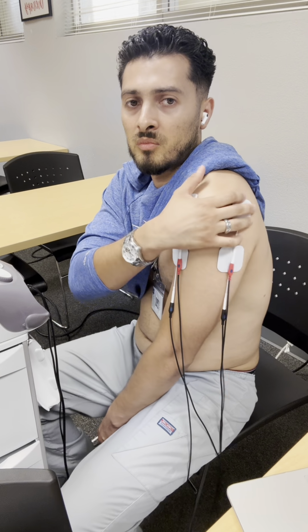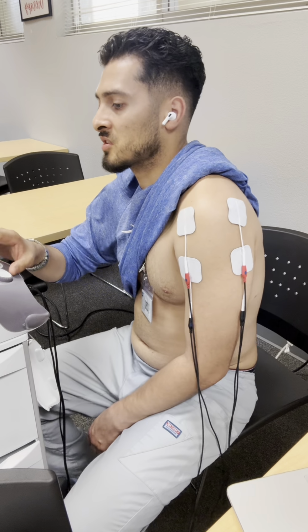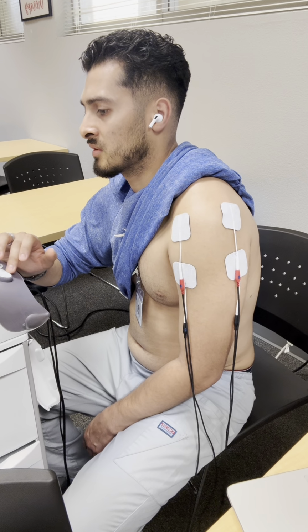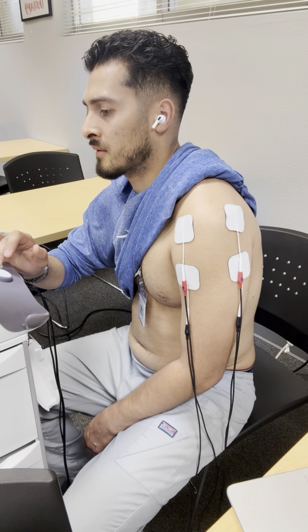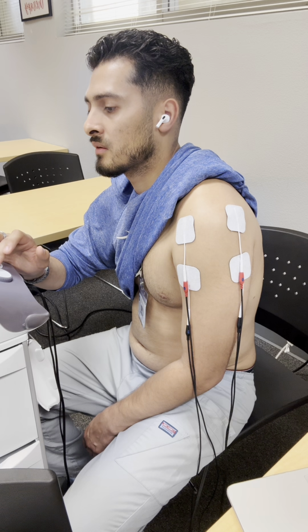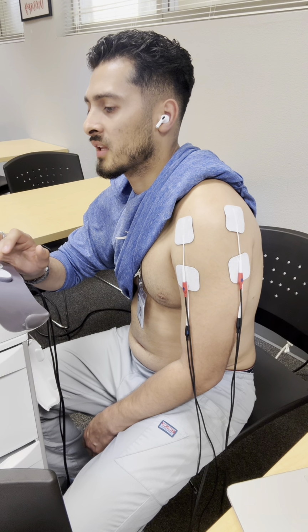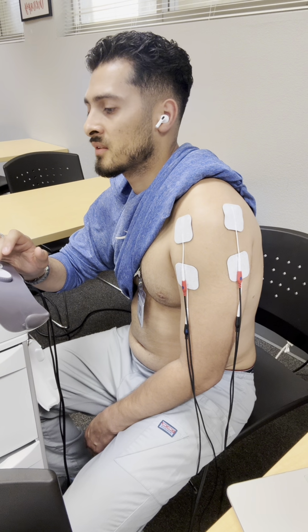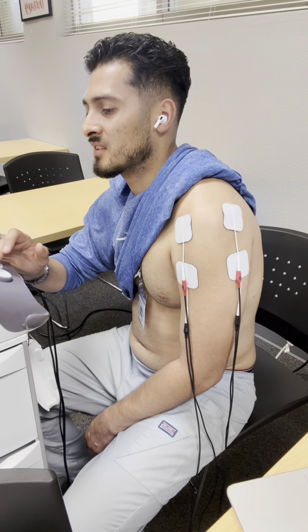There we go, they're in a better position there. Okay, that actually feels better. A little more buzzing and tingling.